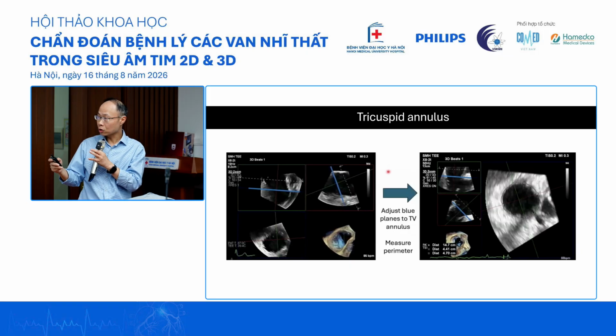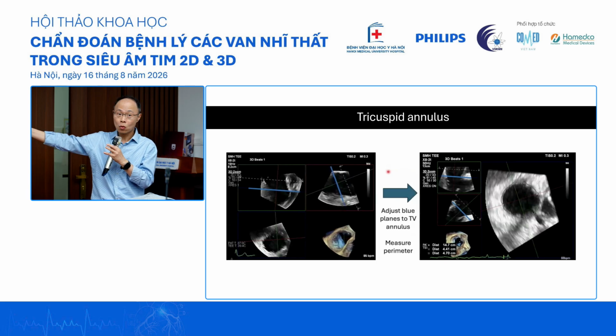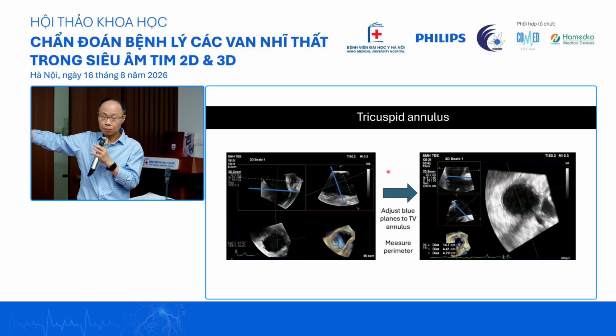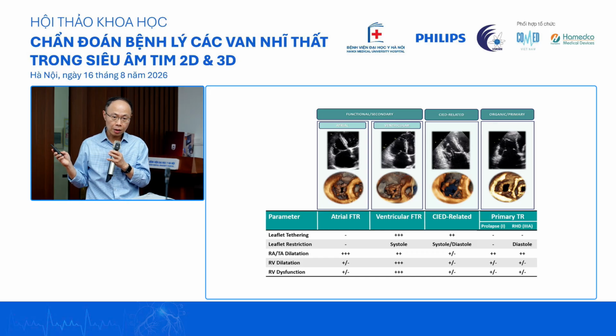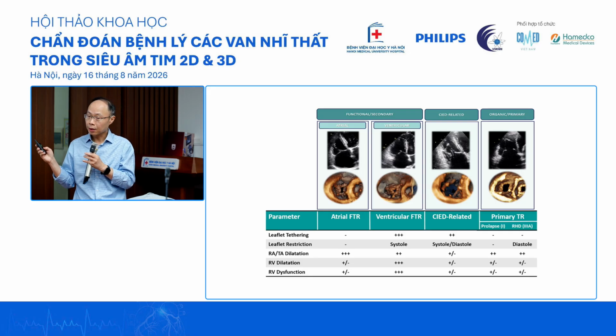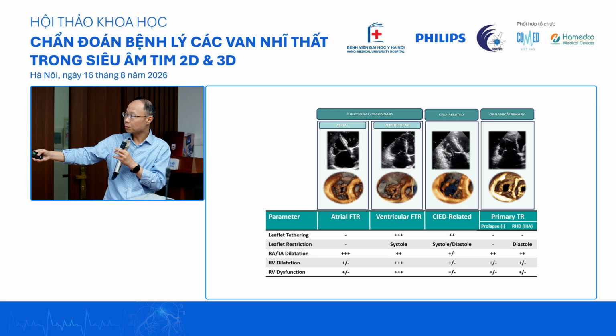And I think while transesophageal echo is really useful if you have a clear image, don't ignore the transthoracic echo for a reliable measurement of the widest diameter of your somewhat oval-shaped tricuspid annulus. And I think this is important because we are also beginning, maybe Prof. Kong can verify, to look at cases where there is a severe tricuspid regurgitation from the pacemaker lead.